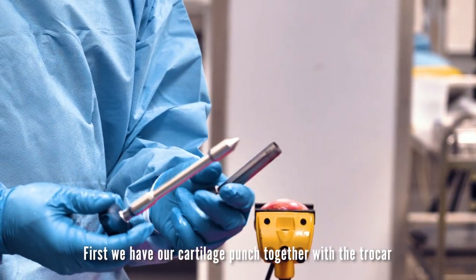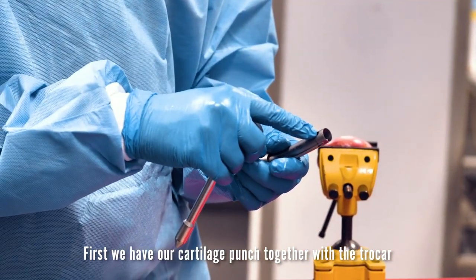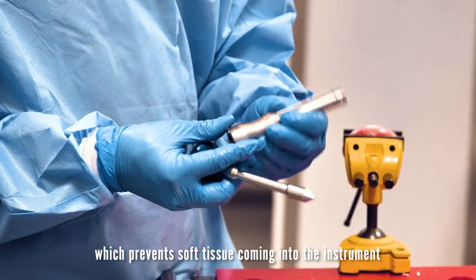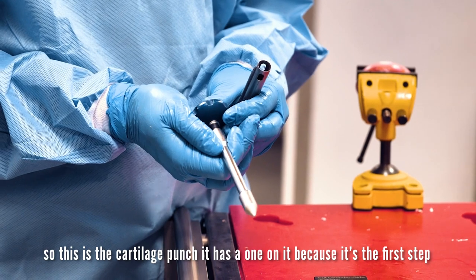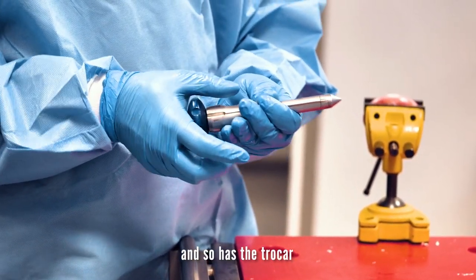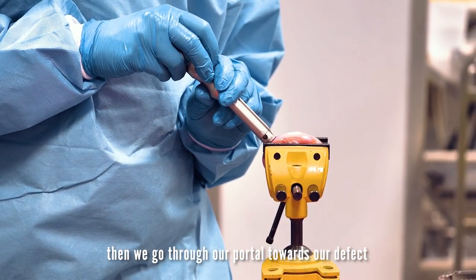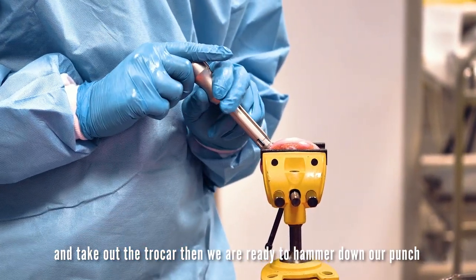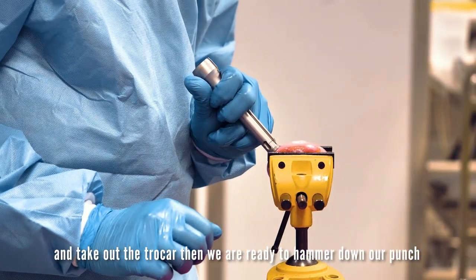First, we have our cartilage punch together with the trocar, which prevents soft tissue from entering the instrument. This is the cartilage punch — it has a one on it because it's the first step, and so does the trocar. Then we go through our portal towards our defect, take out the trocar, and then we are ready to hammer down our punch.